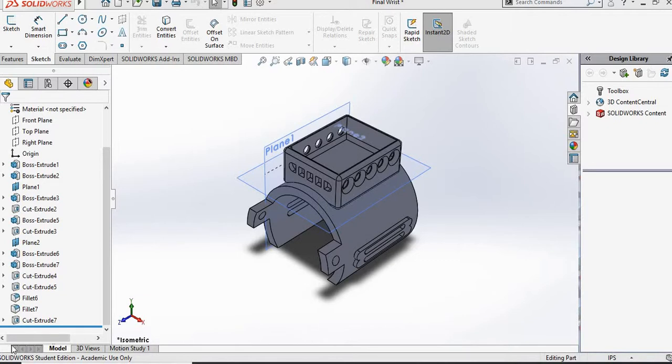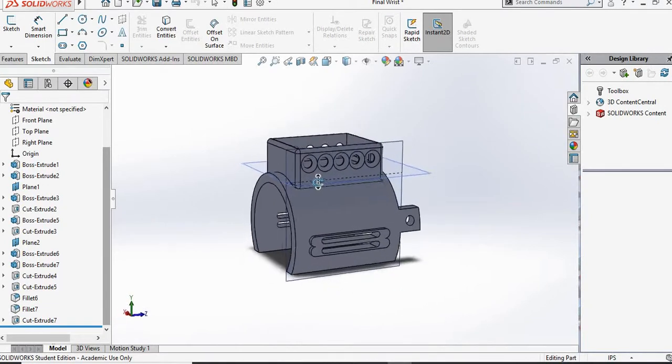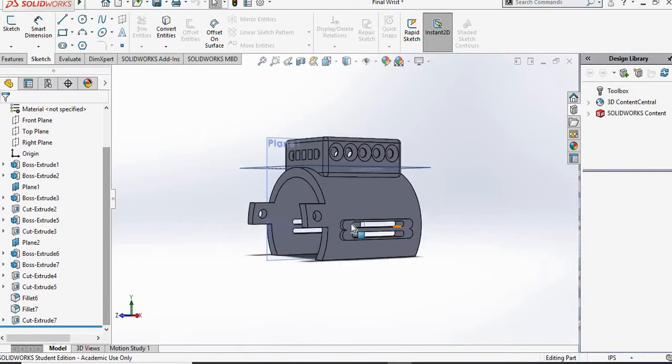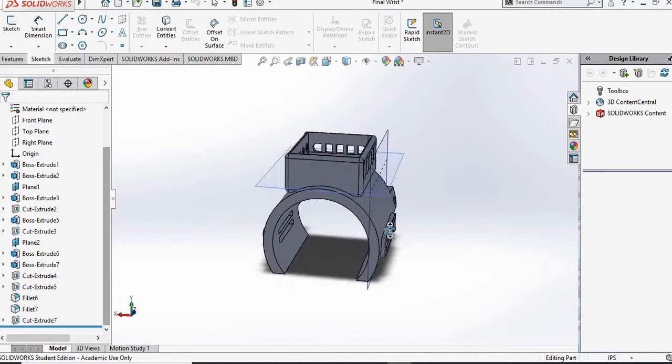Alright, and today we're going to be showing you how to create a wrist attachment to our prosthetic hand prototype. Again, I'm with the BME 60C class at UC Irvine, and I'm part of the flopping floppers. Alright, and so this is what our final design should look like, as you can see here. It's just a wrist attachment, and it has the connector so that it can connect to our palm that we created.